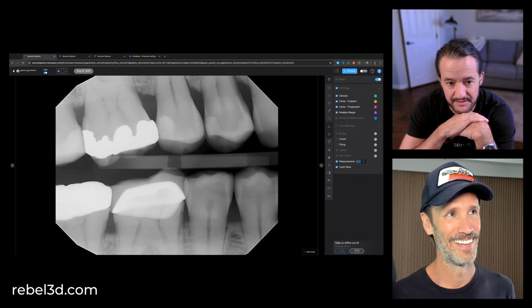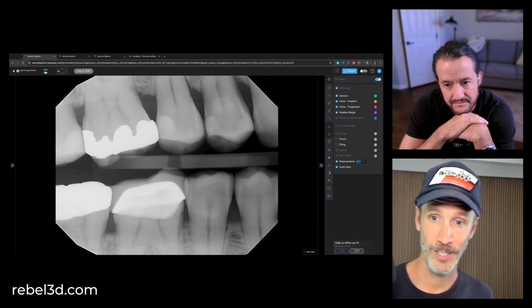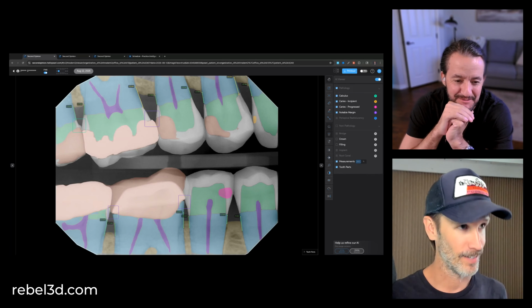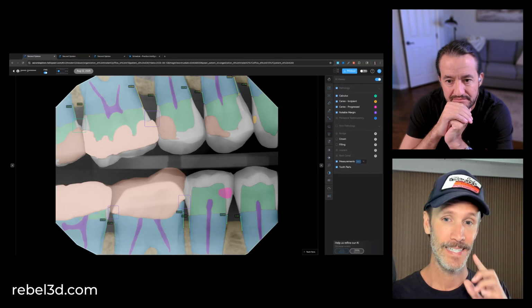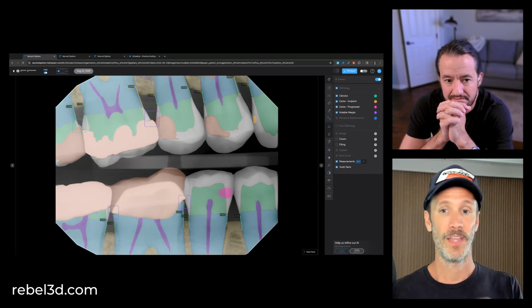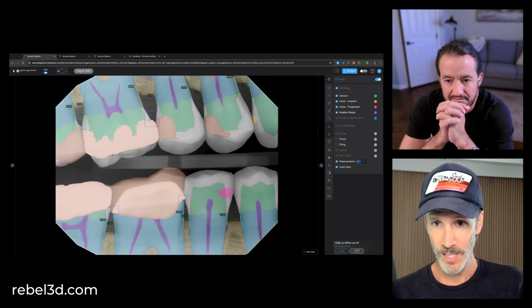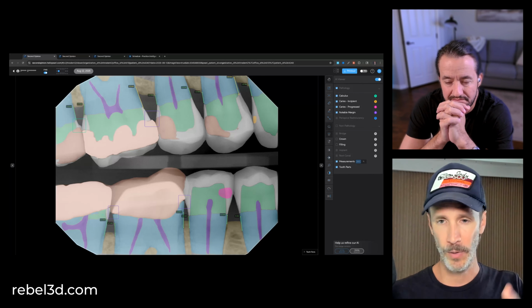Really hard to see. And one of the things is that our small little human eyes see about 50 shades of gray. Okay, like the name of the book and the movie. All right, so those of you that are into that stuff. But an AI can see like 700 to 800 shades of gray. So we can actually find things much sooner than the human eye because it's reading every little pixel change. And what that means is that we can treat it sooner. That can be a preventative, that can be a watch. There's some people that would go in and do a filling there.